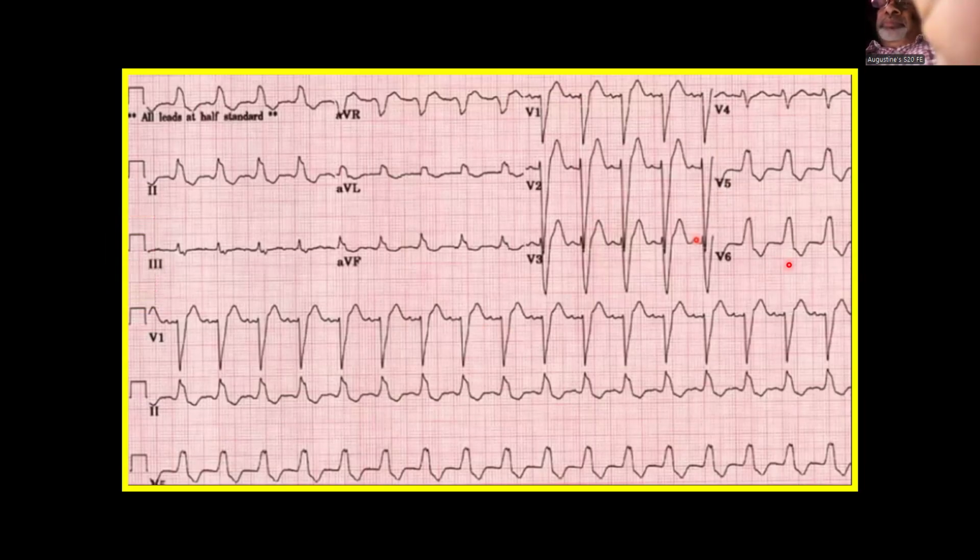But please understand, what do you think about the amplitude? Amplitude is normal or abnormal? It's normal, half the normal, sir. It's only 5, half the normal. Very good, excellent. Standardization. Exactly, super. Always, whenever you are concerned about the height, you must concentrate on the standardization.